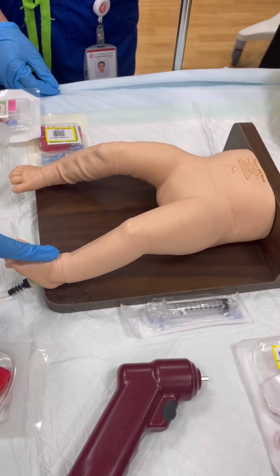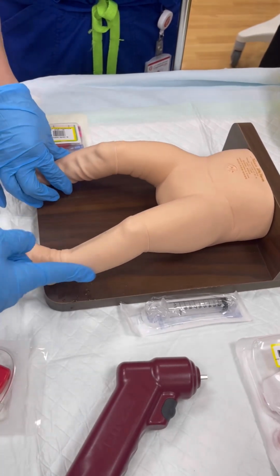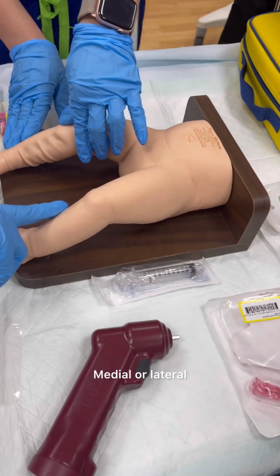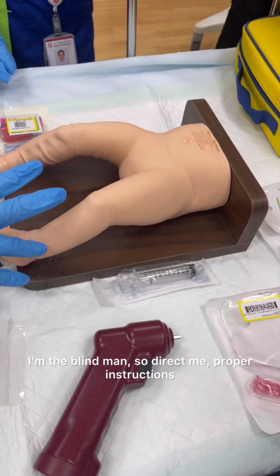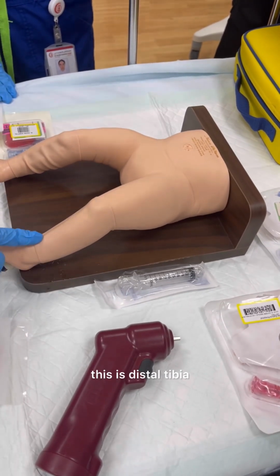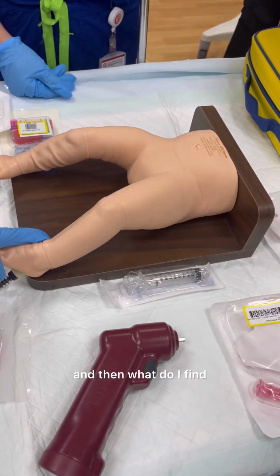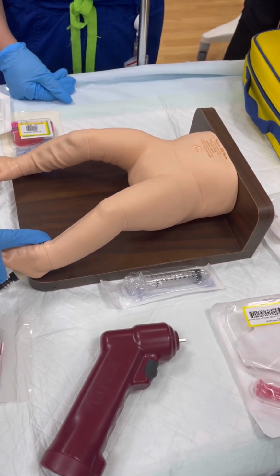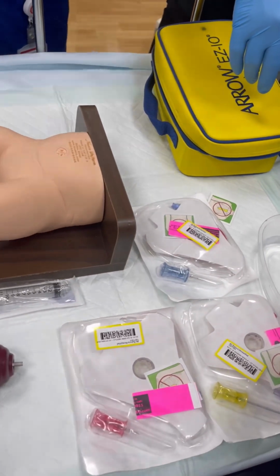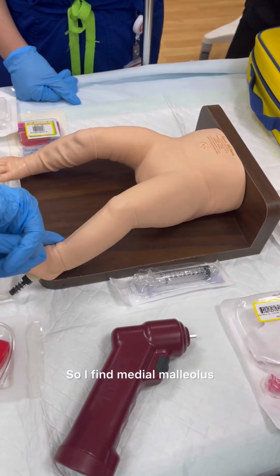Second landmark. I'm the blind person, so somebody has to direct me with proper instructions. I find the distal tibia. I'm going down. This is the distal tibia. Where do I go now? Medial. And then what do I find? Up where? What's the bone called there? The malleolus. Lateral or medial? We have two. I find the medial malleolus, and where do I go?